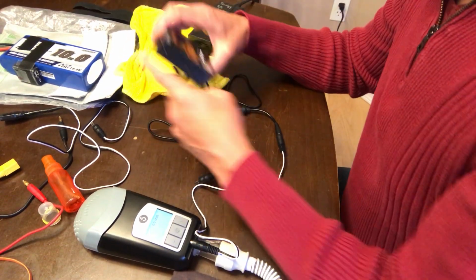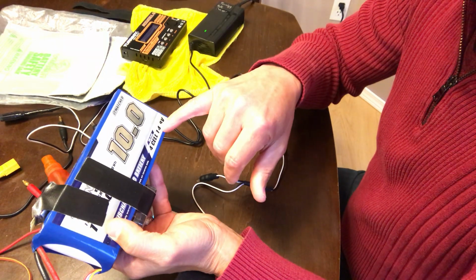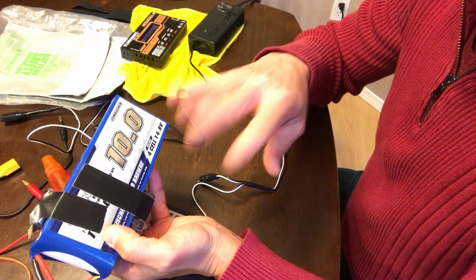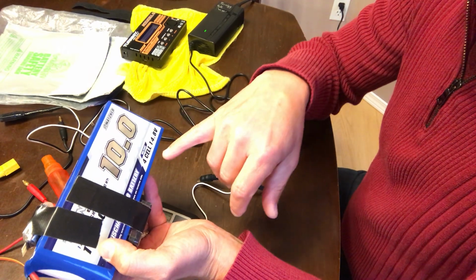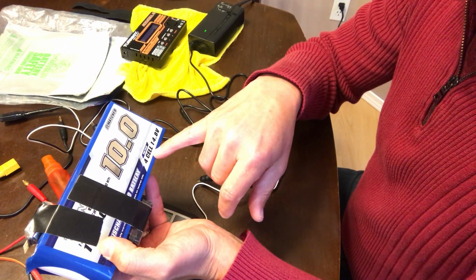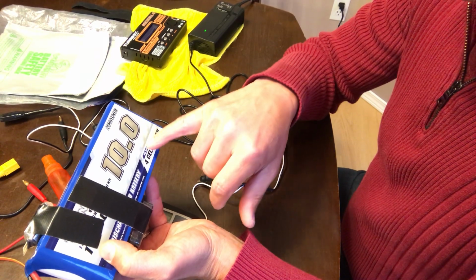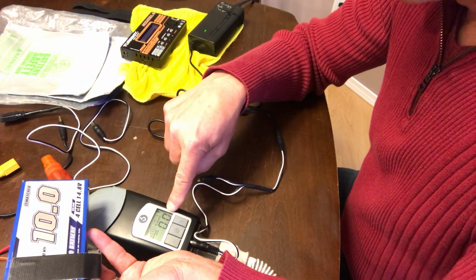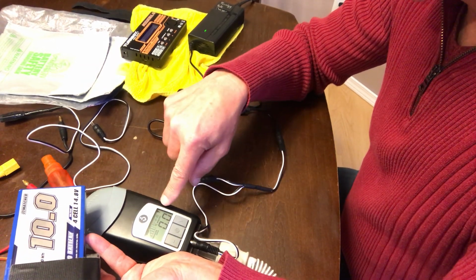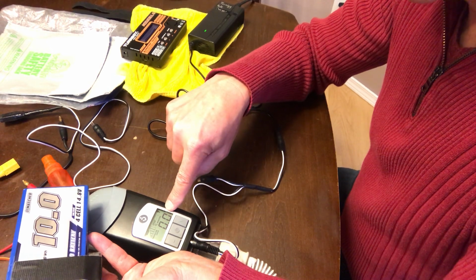So it turns out I had to figure out how many amps I needed to go. I wanted to do 4 days out camping off the grid. So I got a 10 amp battery. This was kind of a trial and error, and this turns out to be 4 or 5 days depending on the centimeters of water that you need to run your device.